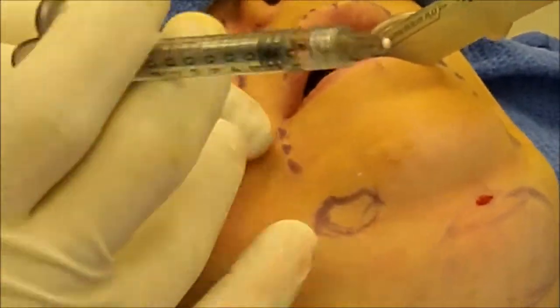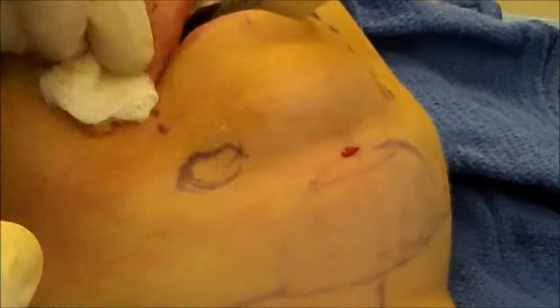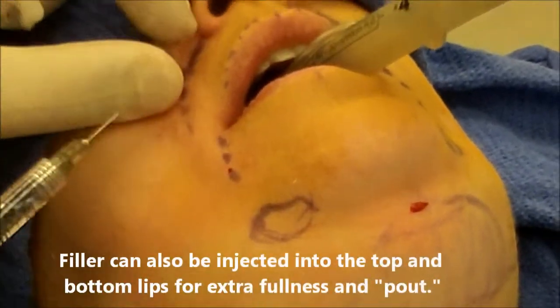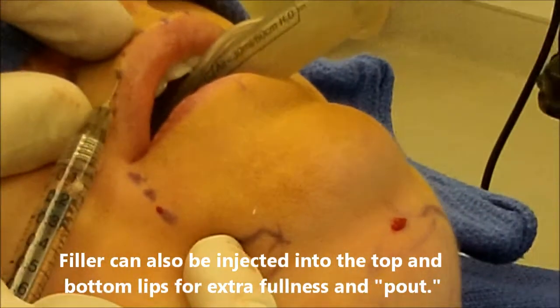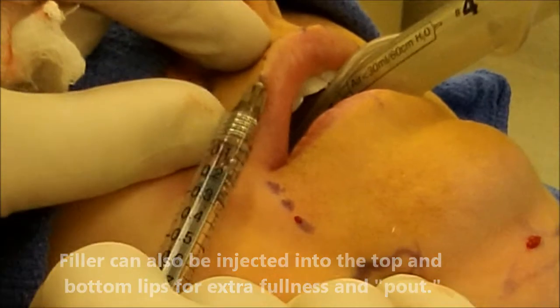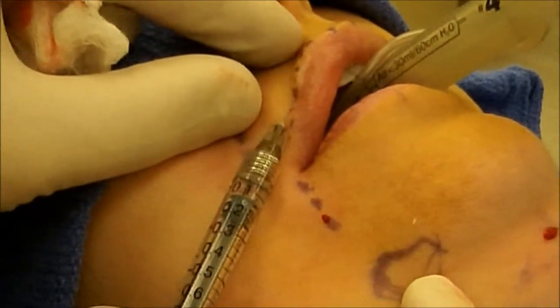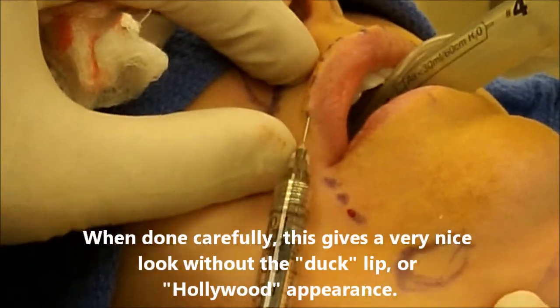Massaging that, spreading it all out so it really sits where we want it to. The last little bit I'm going to use on her lips. She doesn't want big lips, but I'm just going to use a little bit as a filler right along the corners of the borders of the lips, just like a liner — very small amounts right into the lips.